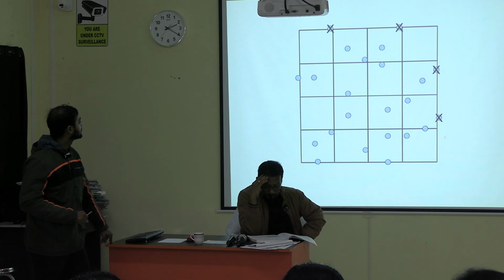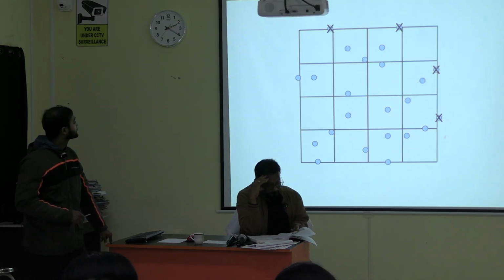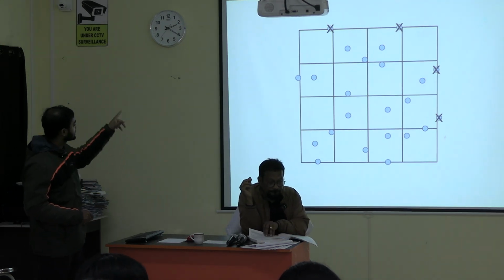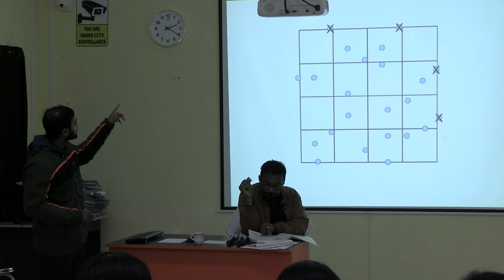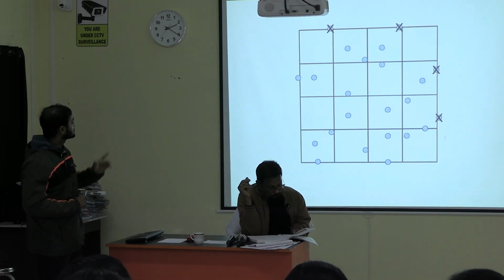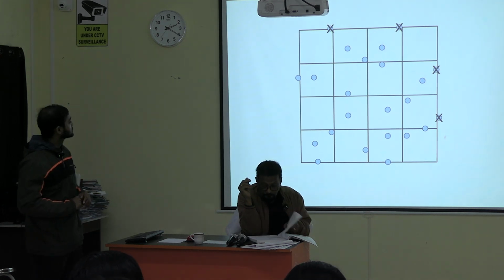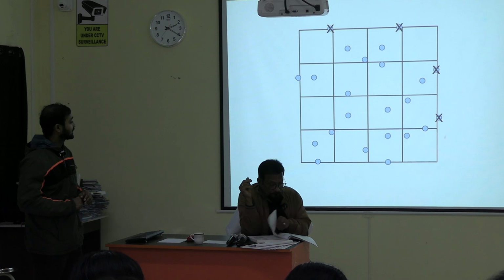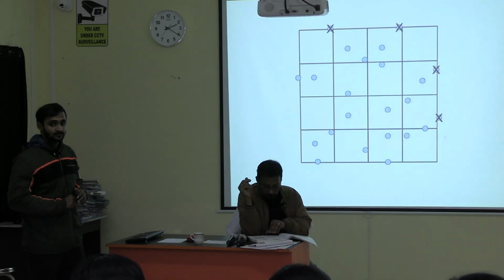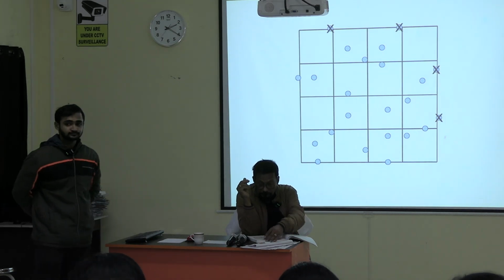So this is a large box now. If we count the left lower box, then we will be counting only the left and the lower portion. So you can count here. Can you count how many cells are there? What is the WBC count of the patient now? Count it.